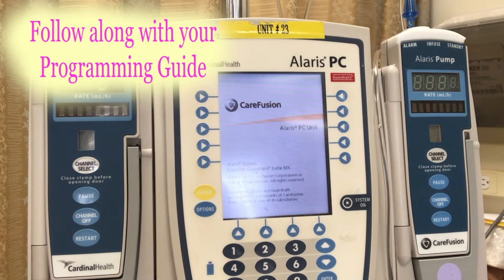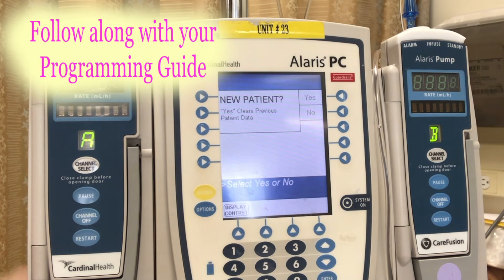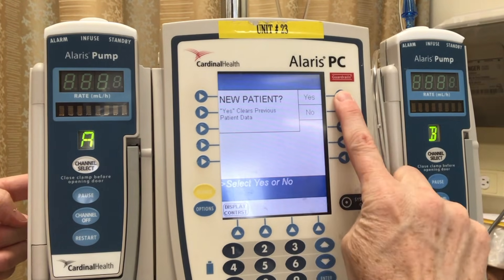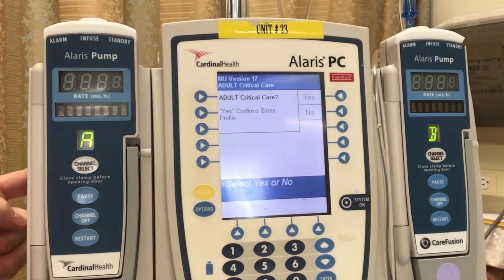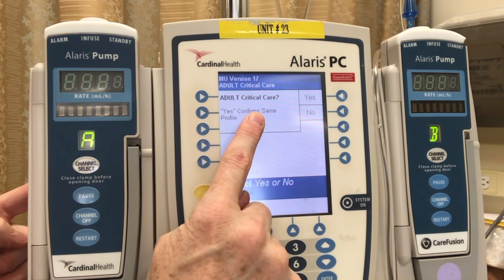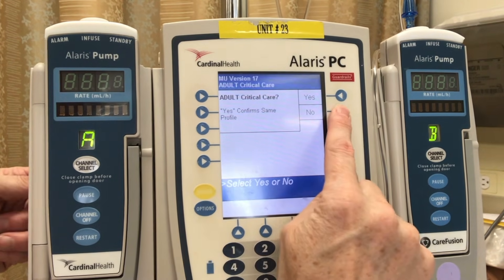The first screen we're going to see is: do you have a new patient? Selecting no means you've worked with this patient for a while and the previous settings will be displayed. Selecting yes will take us to the next screen and ask us if we are in adult critical care. Selecting yes will take us to a specific menu for critical care patients. We're going to select no, which will take us to the menu for the med-surge units.